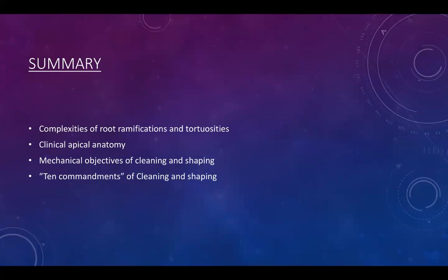First, we have to watch how I'm doing my preparation. Sometimes I notice some students in the clinic using their files and immediately reaching the working length. If they're using a rotary, they stop at that point. They don't let the file work a little bit in the canal. So that helps make sure we're making that conical preparation. Second, we always have to have patency. Try to make sure there's no blockage of the canal. We debride and irrigate a lot.